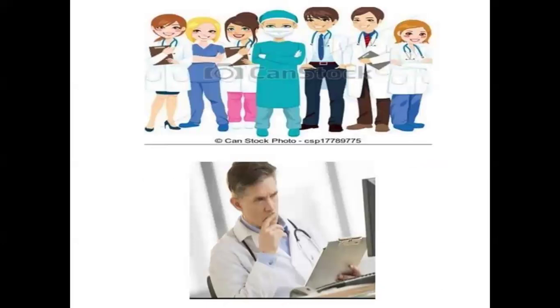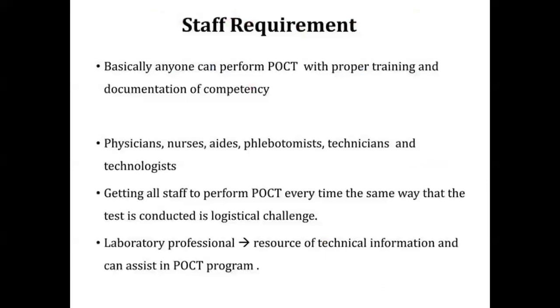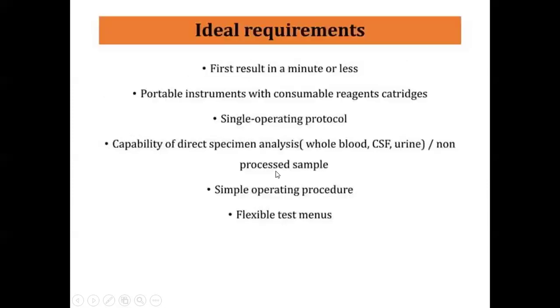So this is very easy now, the clinics are not overloaded, the laboratories are not overloaded. You can self-analyze the things. Though there are a lot of disadvantages, like there will be false positive and false interpretation by the patient. So those things have to be taken care of. And those who do this, yes, they have to be well trained. And even if there is a false positive or negative, the people should be able to know the results.